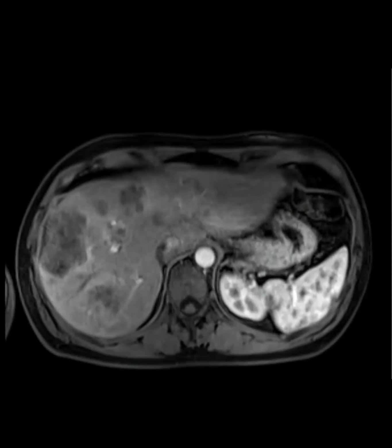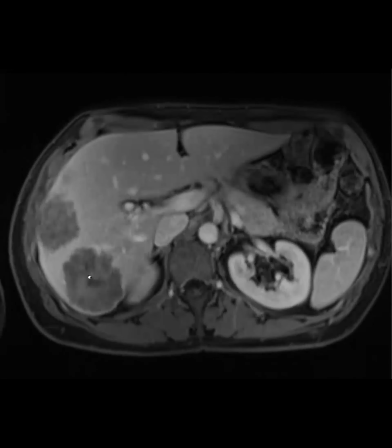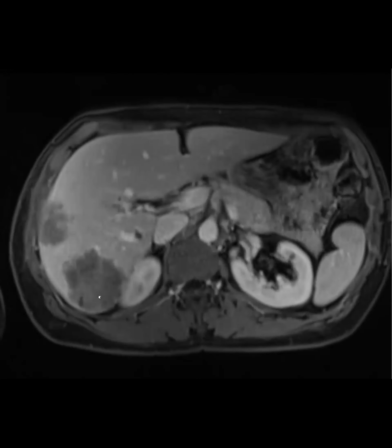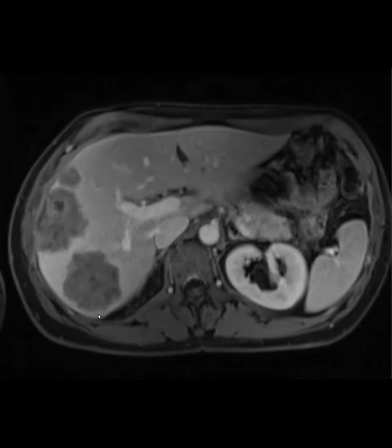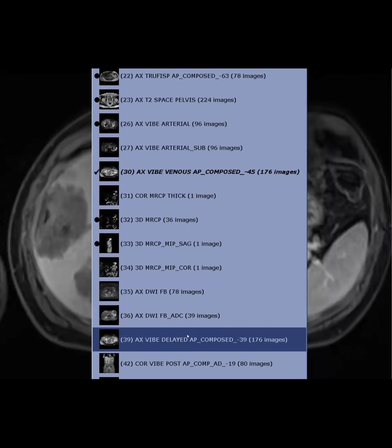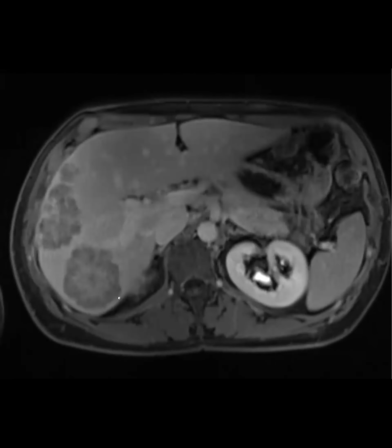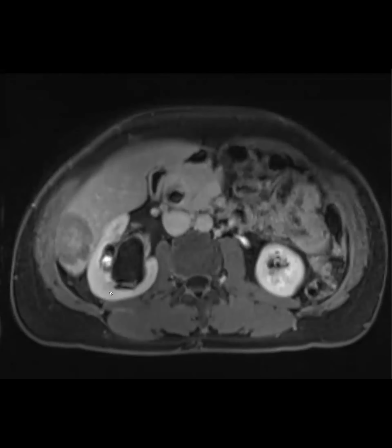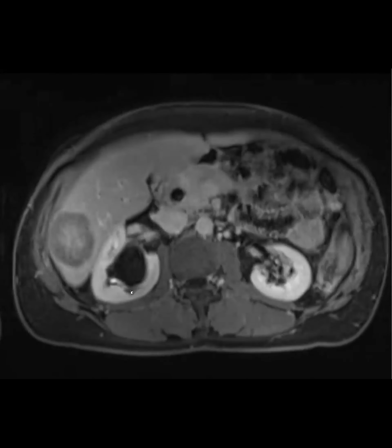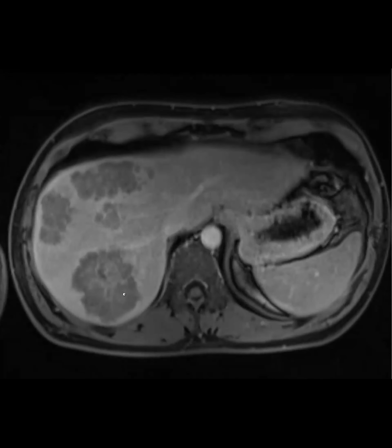This is the arterial phase. This is the venous phase. When I saw these, I saw capsular retraction, you know, kind of lesions that have central scar, multiple. So if I'd just seen one of these, this could have been a good look for cholangio, but with multiple, we're thinking metastatic disease. I thought about colon cancer mets, but in the end, these were acinar mets. So I thought it was interesting because between the first 2 cases, I was like, okay, when they get big, they get necrotic. I could recognize that now, but then this one had a different pattern.